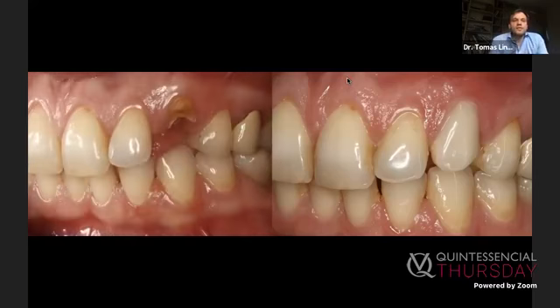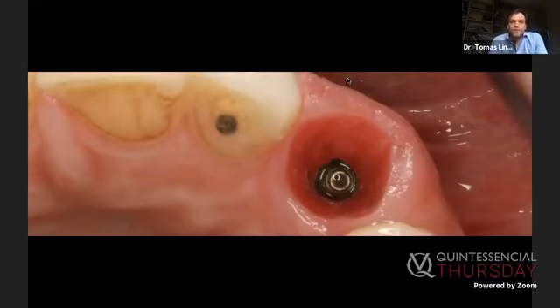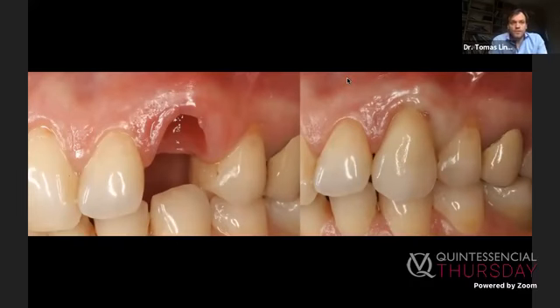And comparing before the extraction and implant placement and after, almost all the contour is preserved. And I see the tissues, again, nice, the shape was preserved. I mean, this protocol, everybody is doing it. It's nothing really difficult or interesting or new.